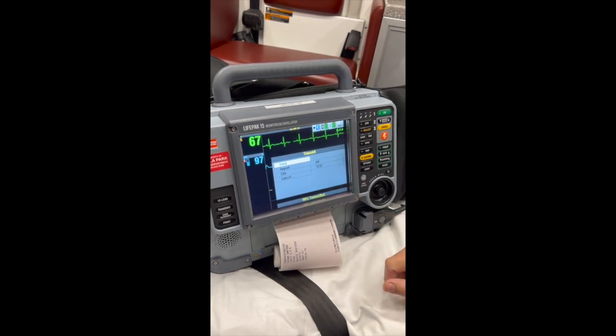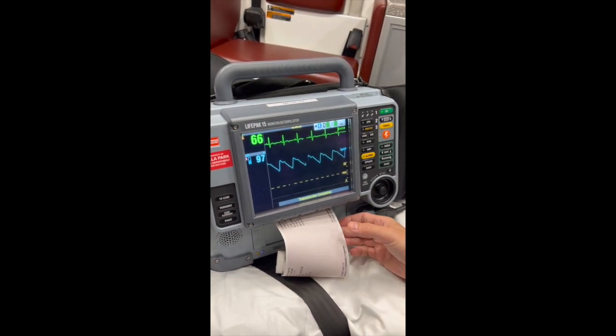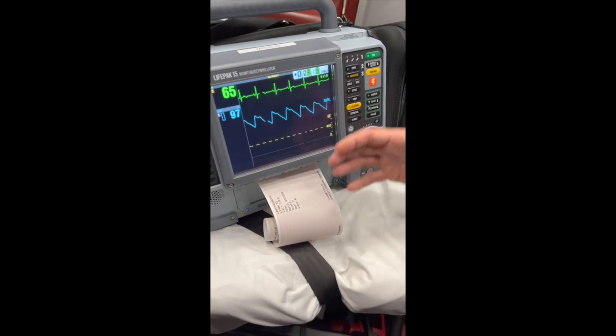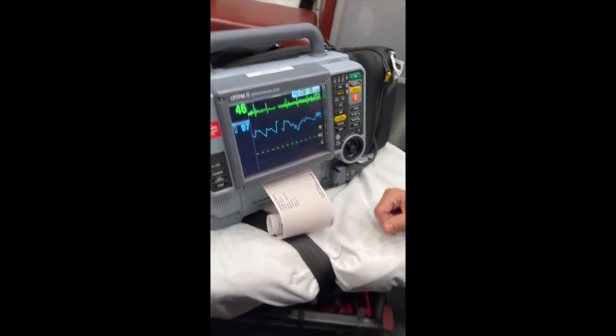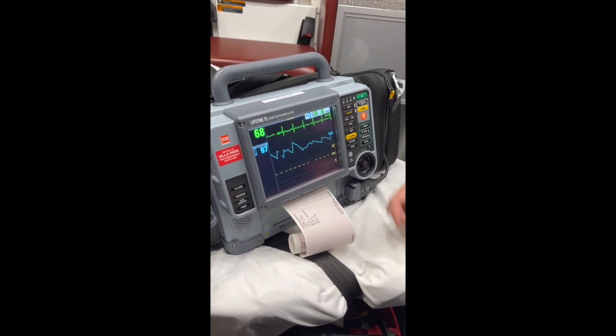So we got 99% transmitted, and we're going to wait to get a transmit complete. So we got a transmit complete, so we know that the connection to the cloud is stable. It's either the hospital or ImageTrend that's having issues. We'll go over how to import all this data in another video.